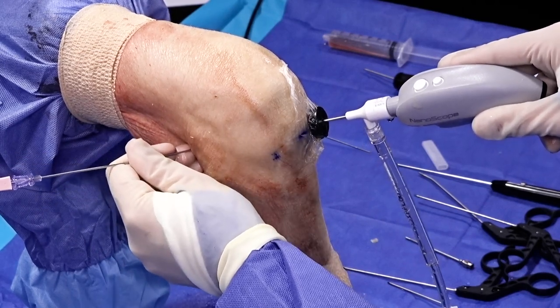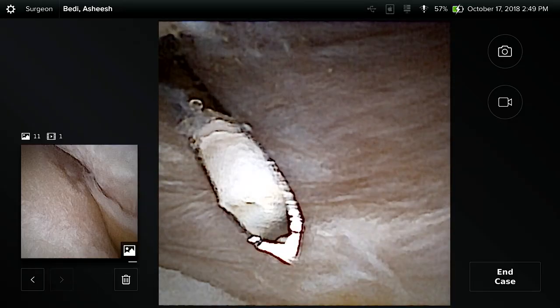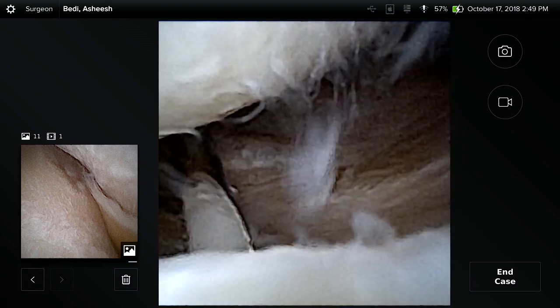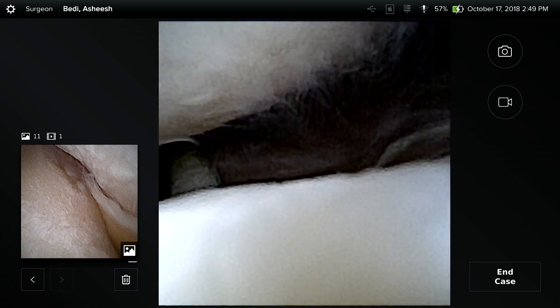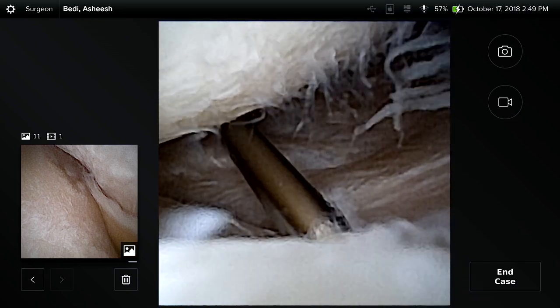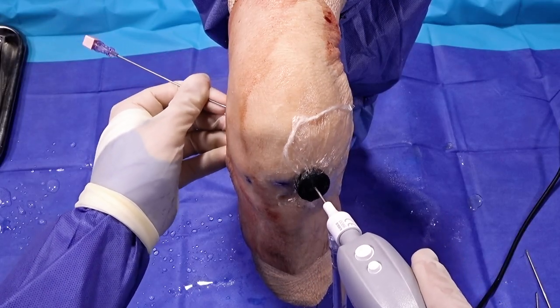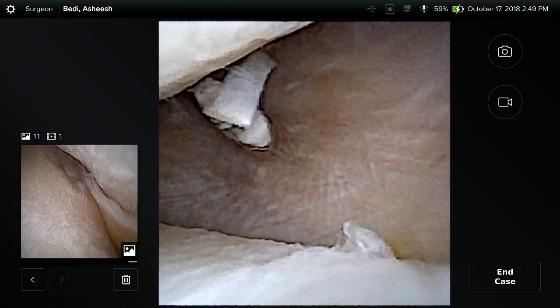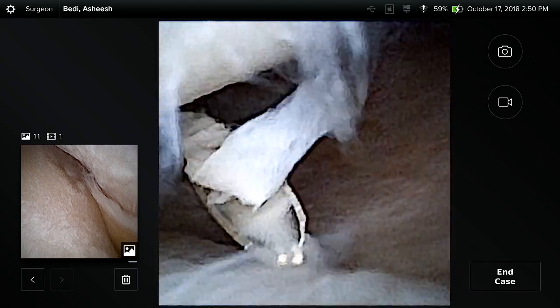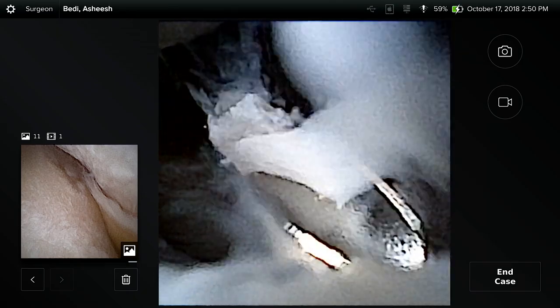We can watch the needle come in directly and there's our needle right there. This allows us to access ramp lesions — there's the posterior aspect of the lateral meniscus — and working medial, this allows us to access a lateral meniscus root. This is a portal we sometimes create to inspect posterior chondral lesions on the lateral femoral condyle or even to place sutures to pull in a lateral meniscus transplant. Having an indwelling cannula here to do that is a tremendous advantage.